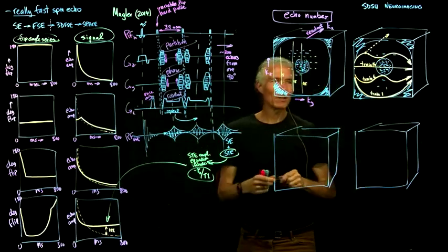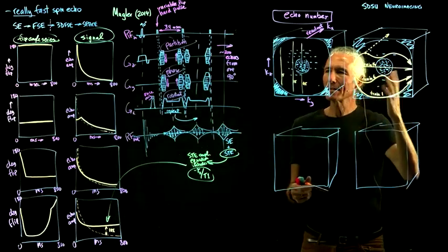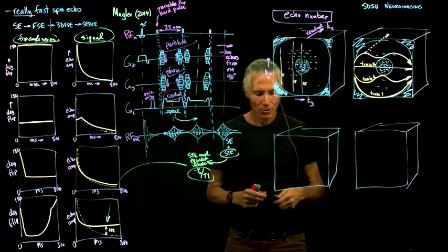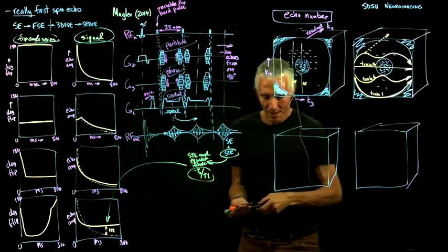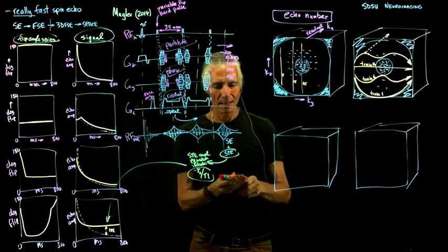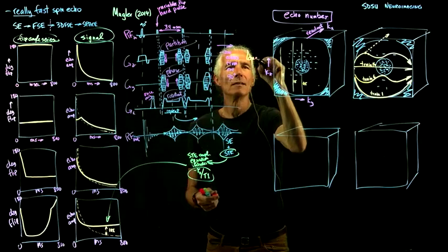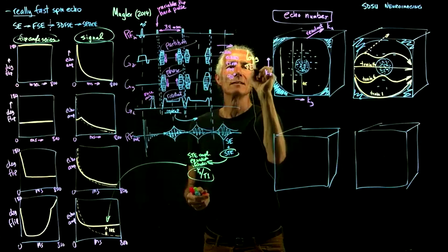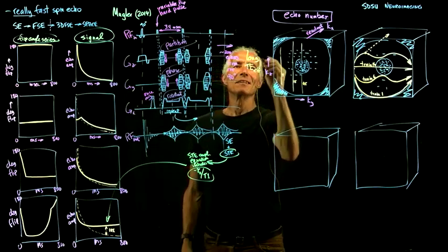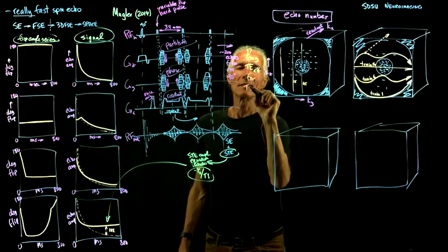But the end result is that you record the center of k-space a little bit late, so that you can get a T2 weighted scan. So this guy would be a long effective TE. And this is kind of like a doubly effective TE, for T2 weighted.